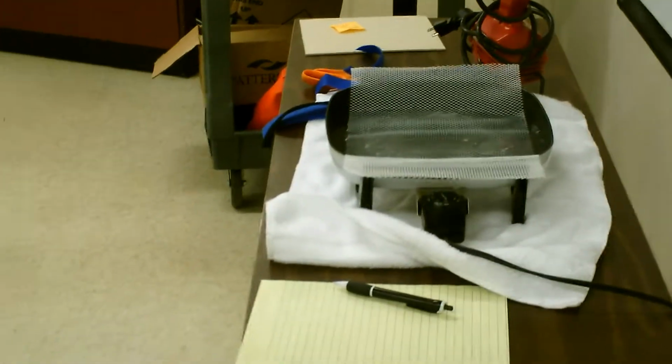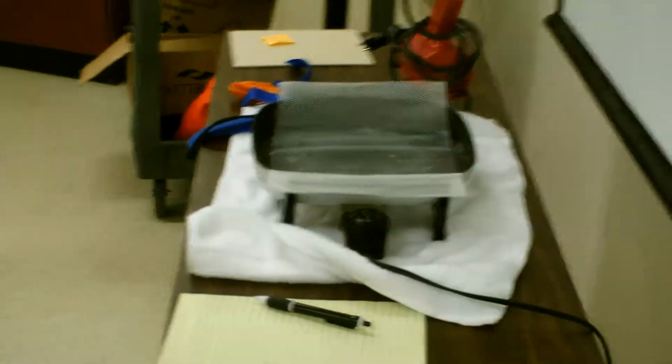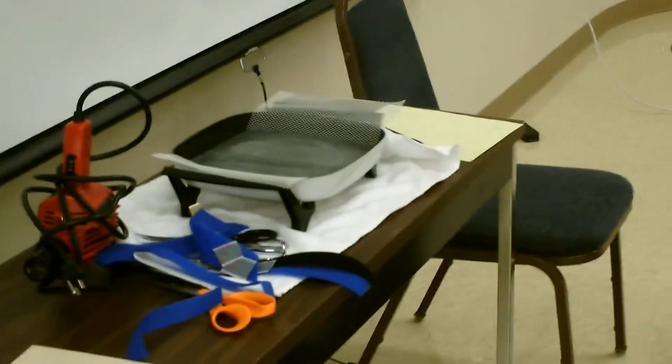How do you know how much to go in by the thumb? Well, I kind of use the actual thumb. It's better to make it a little bigger. You can always cut back. Once it's too short, you can't do anything about that. So, good question. Have a seat.